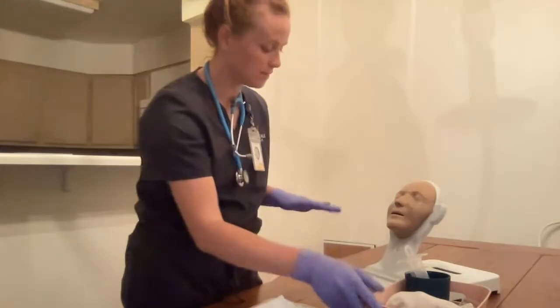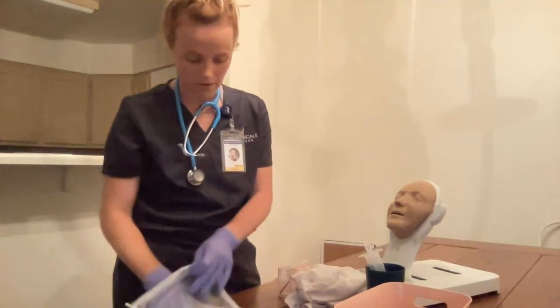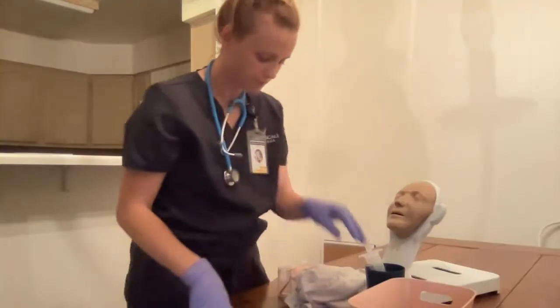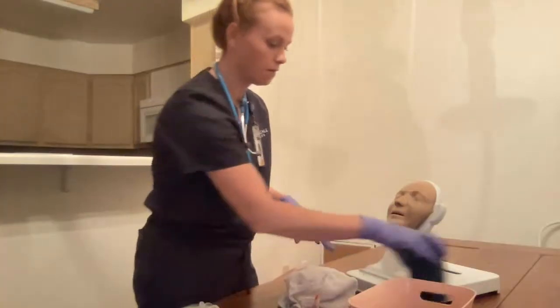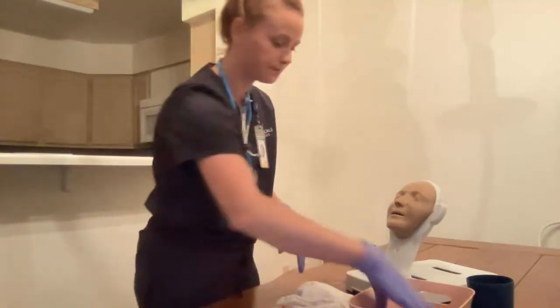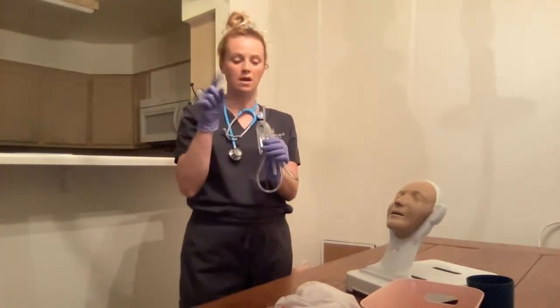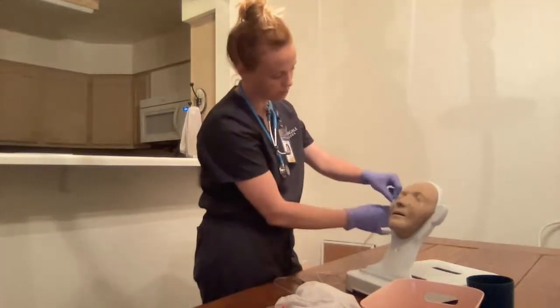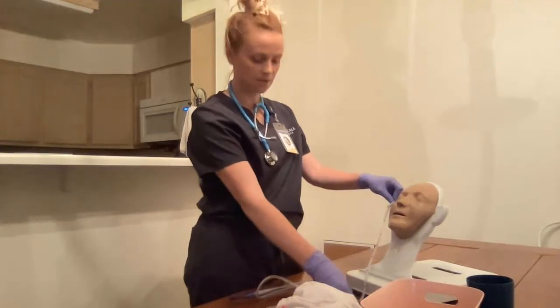Alright, Mrs. Smith, give me just a second. Let me get everything set up. I'm going to place my tubing in the basin of warm water here. Next, we are going to measure the tubing. To measure the tubing, I want to get the tip of the NG tube here. I'm going to put it at her nose and pull it along to the tip of her ear and down to the xiphoid process. That is measuring about 50 centimeters.